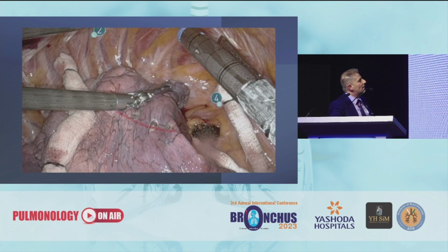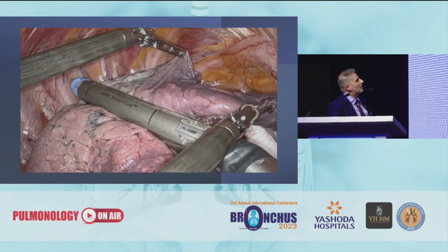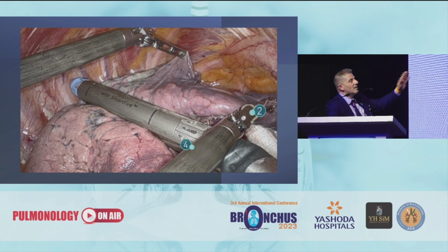After doing that, you have a line for the cut, and it's easier to know exactly where your resection is. Every time you change the light, you can see that you are still inside the lesion, within the part you are resecting. That good feedback means a smaller amount of tissue is removed, with more accuracy, to have free margins.